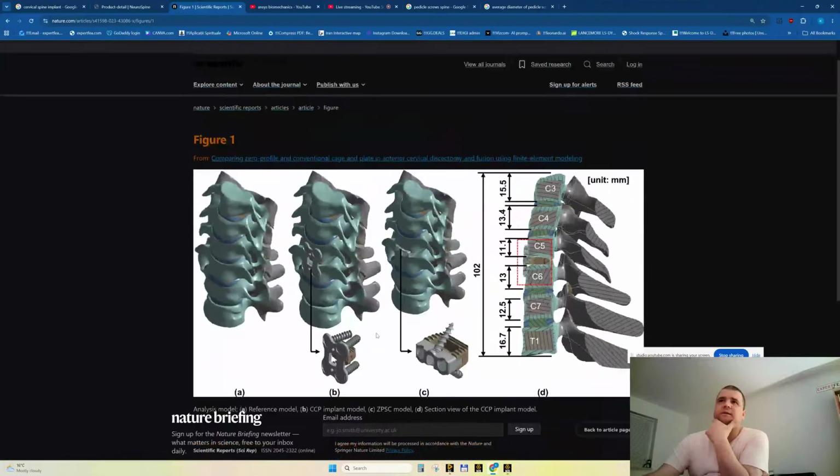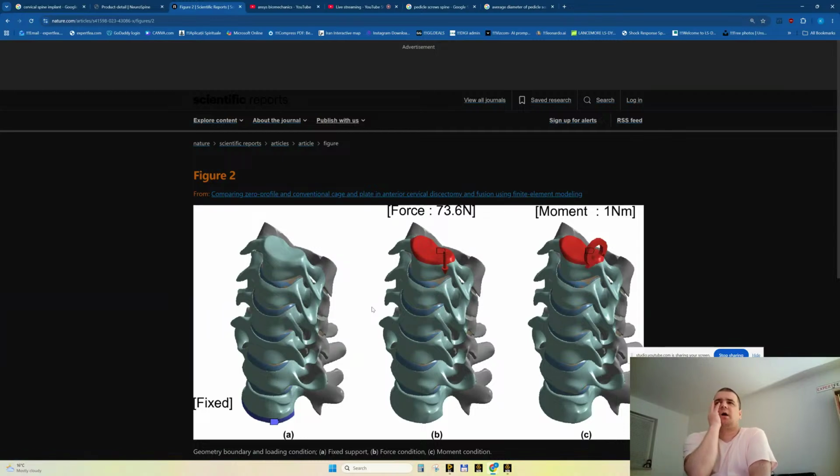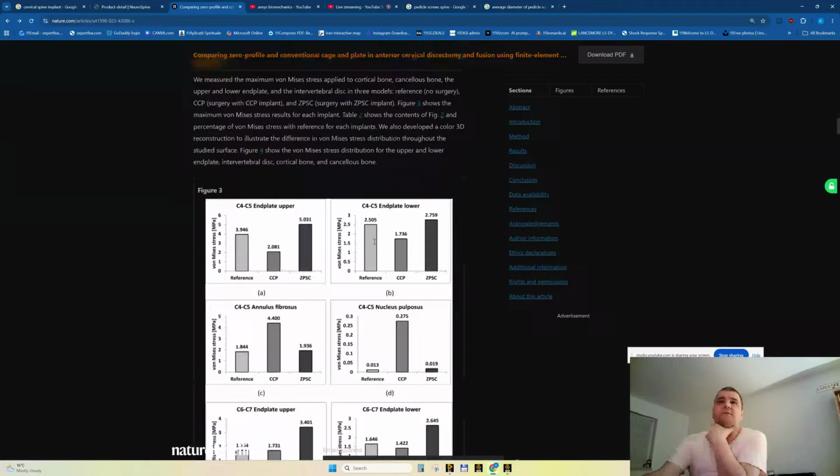How is the moment applied? There is a moment, 1 Newton meter moment, this one. Let's judge it. It's nice because the moment is not applied in order to compress those parts. The moment is applied in order to compress the discs, and also the force aims to compress these discs. So in this loading, this portion is kind of ignored. Also, I dare say that they separated the bodies. So maybe the gray ones and the small cartilages are not part of the FEA. Maybe they are not included, just a supposition.